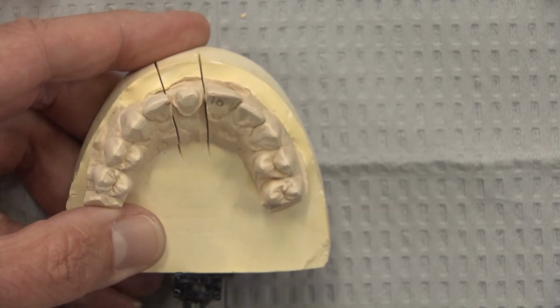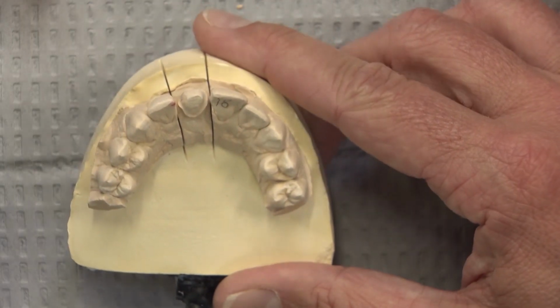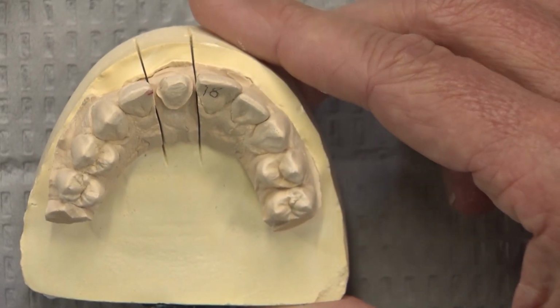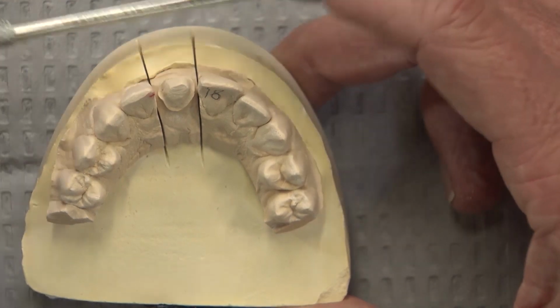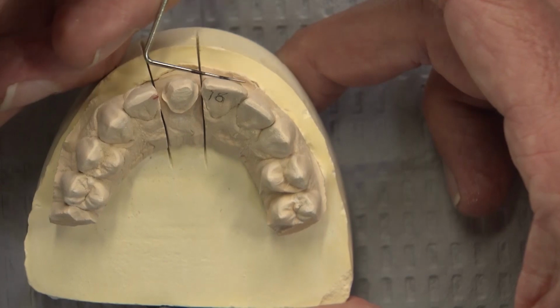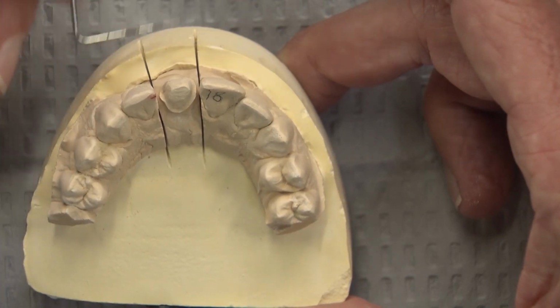One of the things technicians always look at is something that's a little hard to see in the mouth. It's much easier to see on a digital impression, for example. If I take a digital impression of this tooth, I will always look at the virtual model on the screen from this angle, take the most facial part of the preparation, and look at it with the adjacent unprepared tooth next to it.